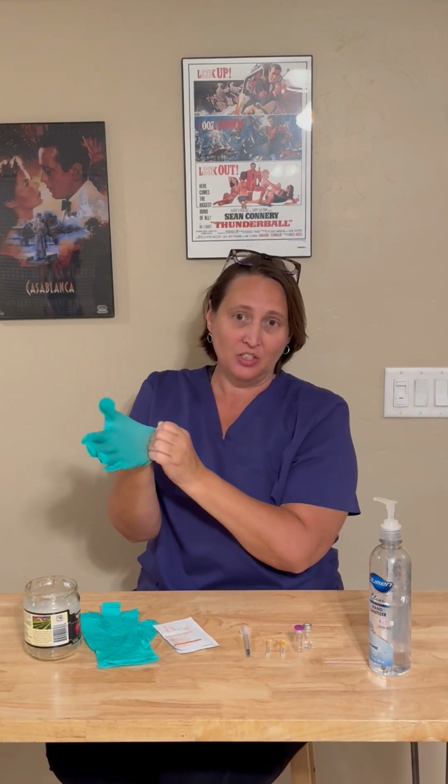Before you do anything, once you've gathered your supplies, ensure you have a clean workspace that's free of clutter. And then you'll need to wash your hands. The preferred method is to wash your hands with soap and water, but if you do not have access to soap and water, an alcohol-based hand sanitizer would be appropriate. So we're going to go ahead and sanitize our hands. Once your hands are sanitized, you'll need to apply your gloves. Never withdraw a medication from a vial without using gloves. This is for your safety and also to prevent contamination in your patient's administration.